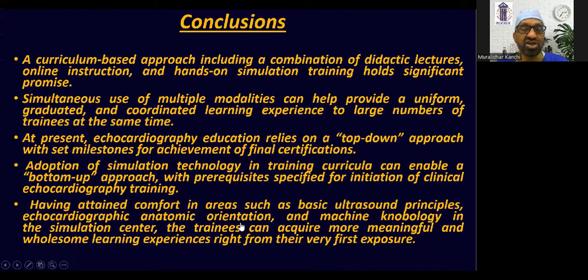At present, echocardiography education relies on a top-down approach with a set of milestones for achievement for final certification. Adoption of simulation technology in training curricula can enable a bottom-up approach with prerequisites specified for initiation of clinical echocardiography training. Having attained comfort in areas such as basic ultrasound principles, echocardiographic anatomic orientation, and machine knobology in a simulated environment, a trainee can acquire a more meaningful and wholesome learning experience right from the very first exposure in the clinical environment.